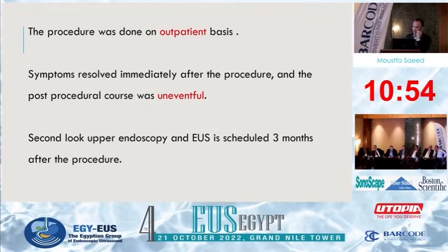The procedure was done on an outpatient basis. Symptoms resolved immediately after the procedure, and the post-procedure course was uneventful. Second look upper endoscopy and EUS is scheduled 3 months after the procedure.